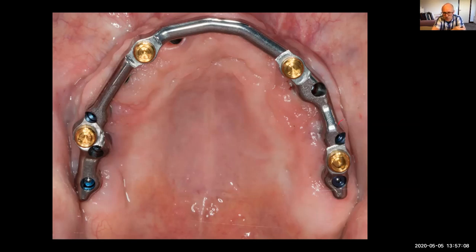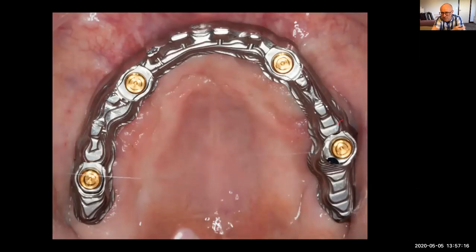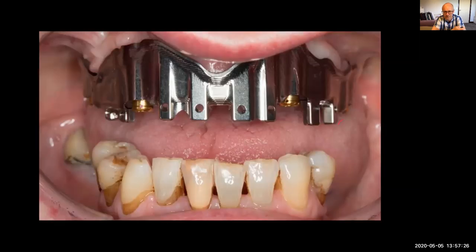So this is a milled parallel bar. So that fits into the mouth. And then over the top of that is machined and milled a sleeve that fits that bar perfectly. That sleeve fits inside the denture itself, like this here. So that sleeve fits over the bar. And in fact, we get 2 sleeves made at the same time, because we make 2 upper overdentures for the patient in these circumstances, because they break, they wear them out. So it's nice for them to have 2.